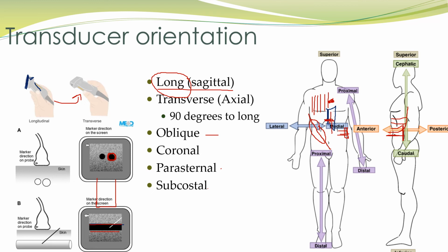And we always say windows when we're talking about just different things that you can see through. So sometimes if I'm right here, transverse substernal area, I might be getting a lot of interference from transverse colon air. So I might have to try a different window to say, look at my aorta. Maybe I'd have to come coronally and scan through my patient's side, obtaining an image of my aorta, a slice of my aorta that looks something more like this. So lots of different options that you can work on your windows. Don't be afraid to move and try. If you're always thinking about it as a slice, don't be afraid to try different areas.